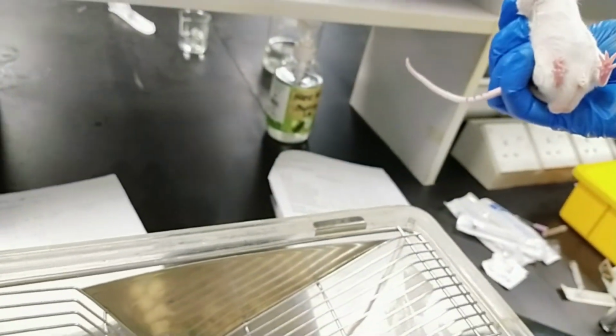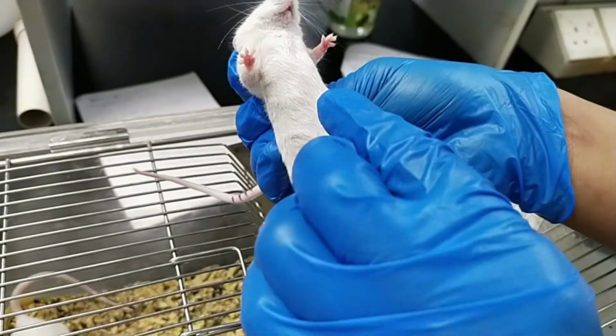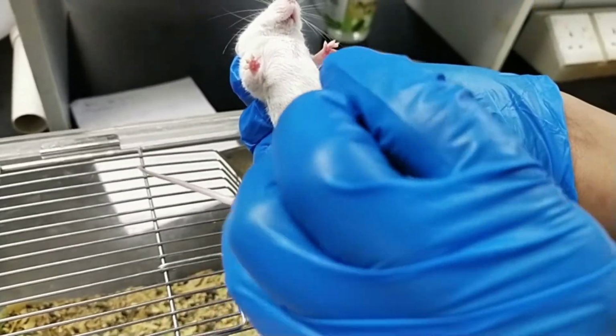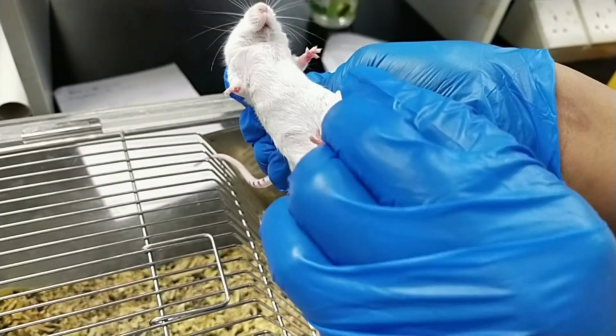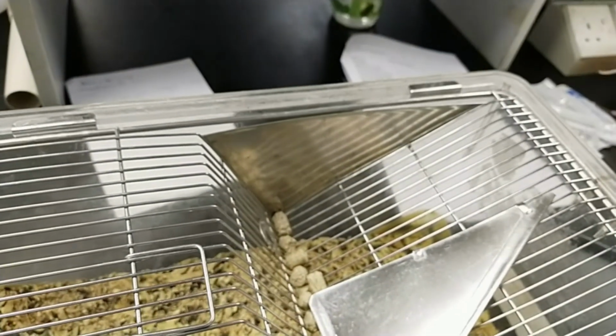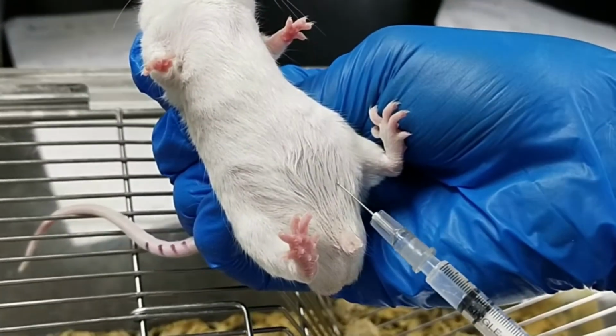And before that, we need to apply the alcohol swab as well at the injection area. Okay, so we're going to inject it here.